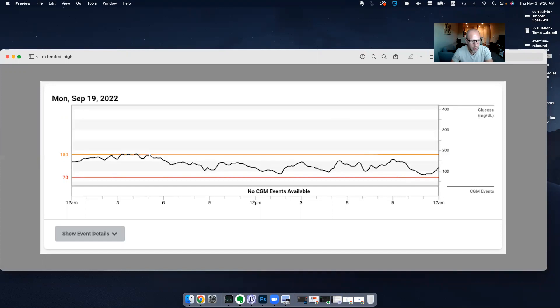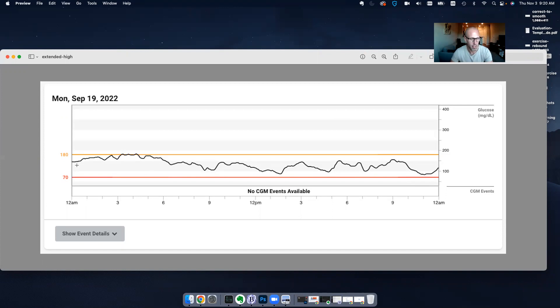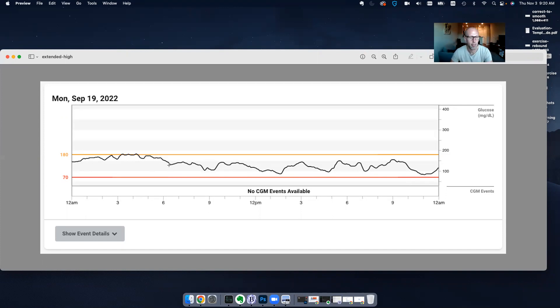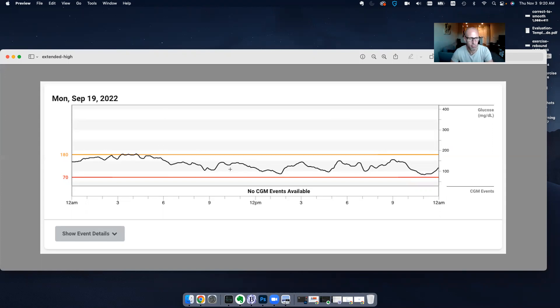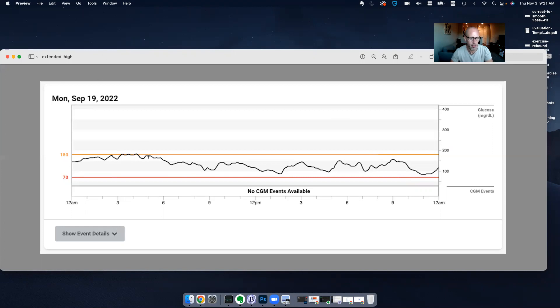So you can see it's 12 AM right here. I'm at about the 160 range and I come up to 170 or so, I hit 180, and then I kind of just stay at 180 for a long period of time. Eventually I have a nice smooth descent and I come down and then I go about my day. But this was an example where I actually didn't wake up and give myself a manual correction. So I tried to rely on the Omnipod 5 doing the automated adjustments in the background. And you can see that 12 AM to really 6 AM is quite a lot higher than I wanted. So that's six hours of being out of the range that I would like because I was relying on those background basal adjustments to bring my blood sugar down. So helpful, but not ideal. And it's not the quickest fix. So that's really the extended high. That's something to look out for if you see that on the graph.